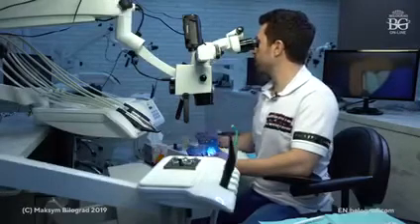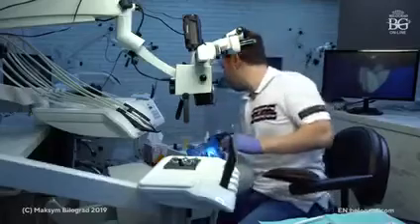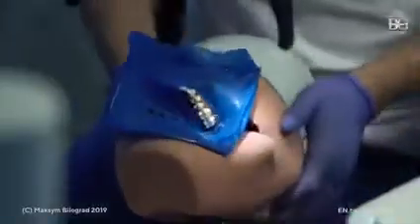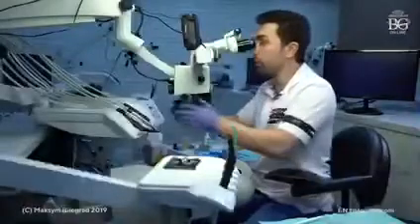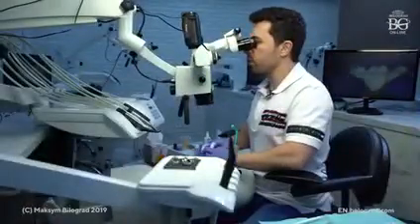So basically, stage 1 was provided pretty precisely in terms of depth preparation. That's fine. So what does that mean? During my second stage of preparation with the red burr, I don't need to increase depth of preparation. I would need just to make my preps smoother and more precise.